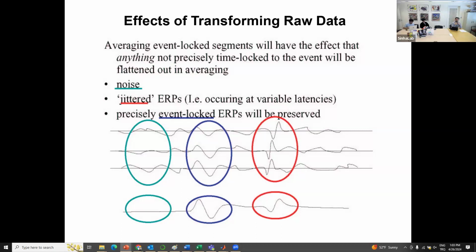Even if you are psychologically under pressure, like before exams when we were students, if you look at the EEG of a psychologically pressured brain, you will realize that this phase lock assumption is no longer true. Unfortunately, the signals start showing phase differences in different frequency domains, because of a possible threat or some other external phenomena that's modulating your EEG.